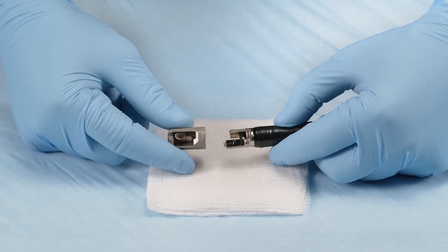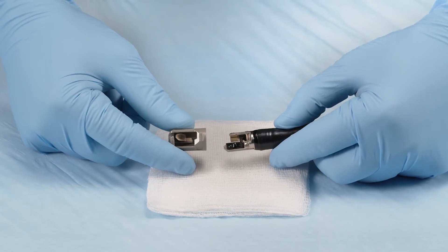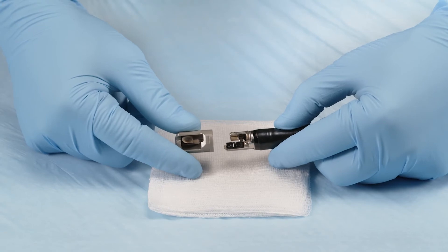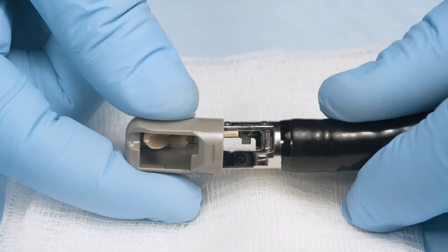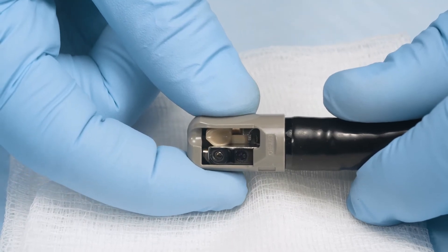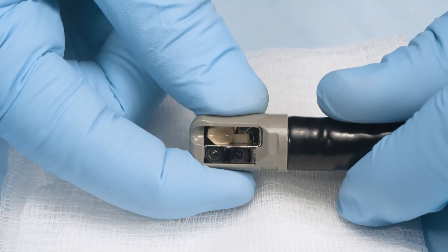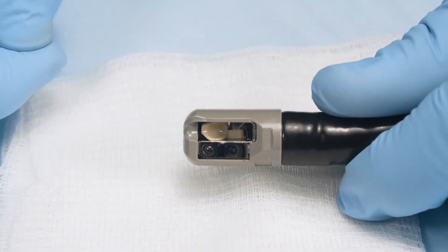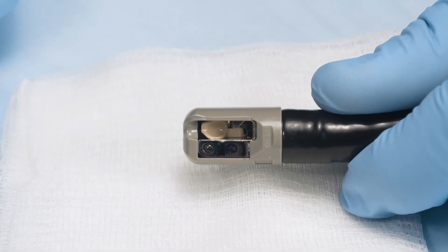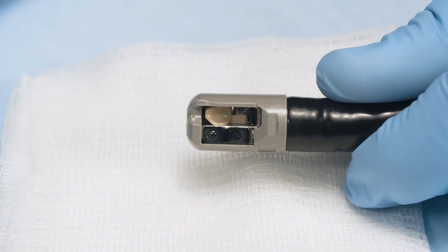Align the cap opening with the objective lens at the distal end of the duodenoscope, and slide the elevator cap onto the distal end. Push the distal end cap inward until the groove at the distal end of the endoscope is completely covered and until you feel and hear it click into place. Ensure that there is no gap between the distal end cap and the metal at the distal end of the endoscope. If there is any gap, push it further and ensure the elevator link is in the proper position.